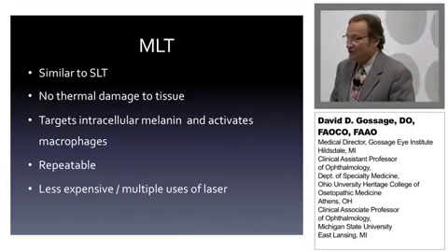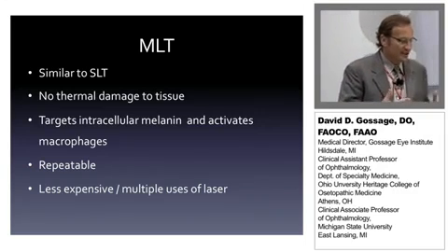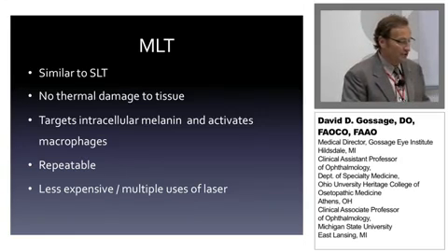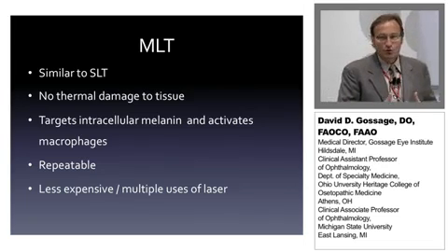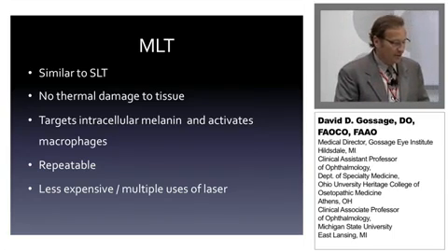Now, when we look at MLT, which is using the MicroPulse technology, it's very similar to SLT in the sense that there's no thermal damage made. We think it does target the intracellular melanin and activate the macrophages to stimulate outflow of fluid within the trabecular meshwork. We do know it is repeatable. I have repeated it so far, and I've had results with that.